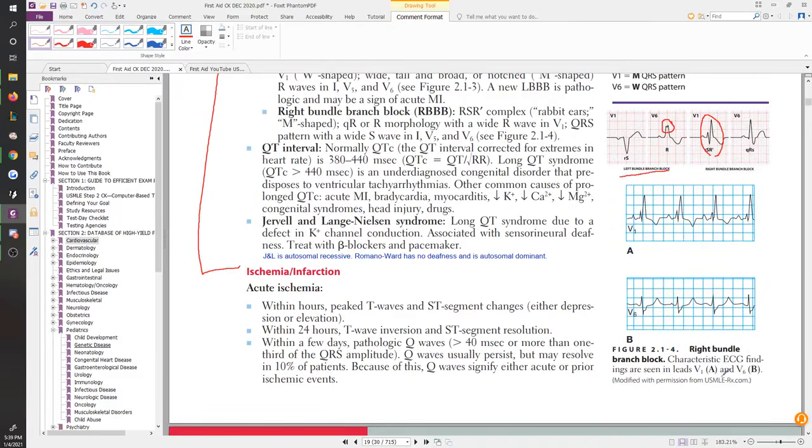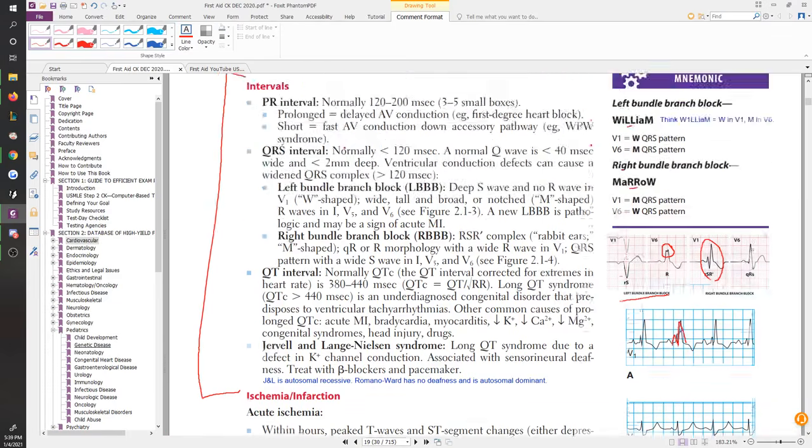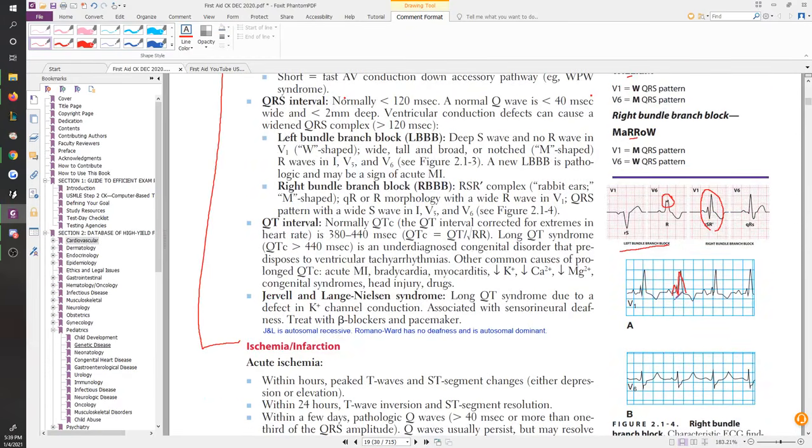So in the book itself, they have, again, a right bundle branch block, and immediately in the V1, you can see there's an M happening, right? So there's 4 different complexes here, so if I trace it in this middle one, it's just like that. That's your M. Okay, so you're seeing that, and then because Marrow is supposed to have a W in V6, but that's often very difficult to catch. So they've drawn a couple complexes here. If I trace it for you, it's basically looking like that. That's not the prettiest W in my opinion, so it's not the easiest one to catch either. I depend more on finding the M, right? That's what I do for most ECGs.